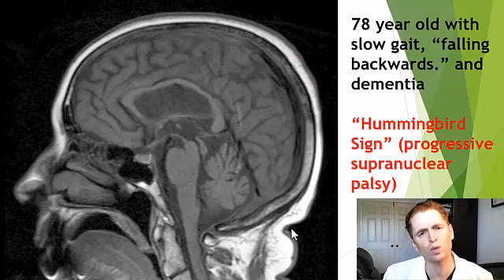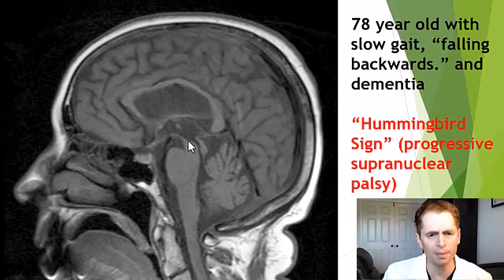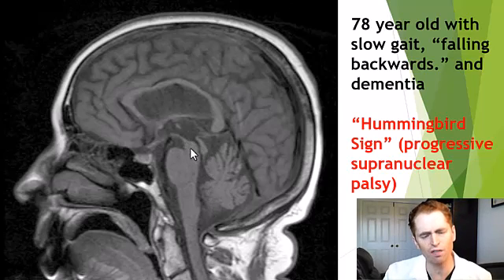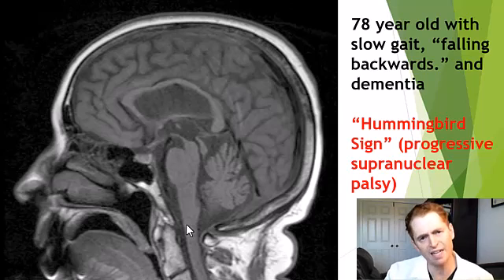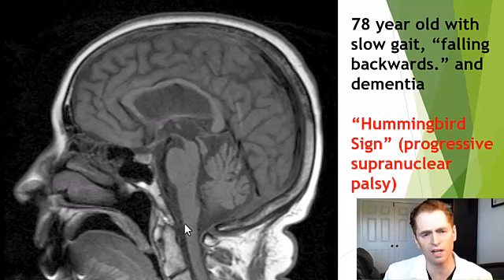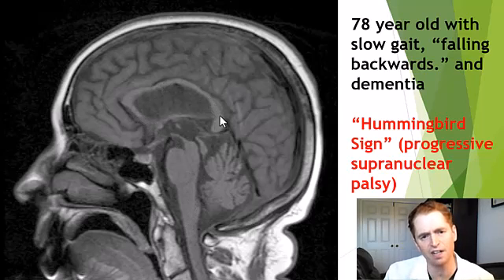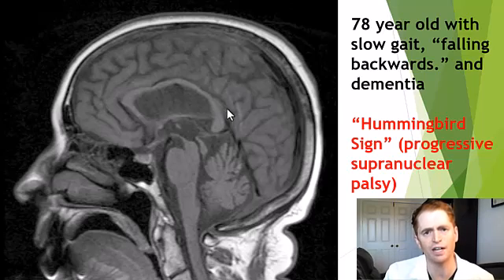This was the 78-year-old with walking difficulty. Here you can see the hummingbird sign — the midbrain is shrunken and atrophic compared to the normal pons, giving the appearance of a hummingbird. You can see the beak and the tail, consistent with PSP, progressive supranuclear palsy, a form of Parkinsonism. On the same film, you can also see some atrophy of the corpus callosum, not necessarily associated with this condition.